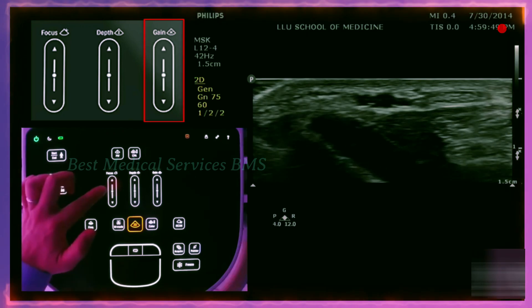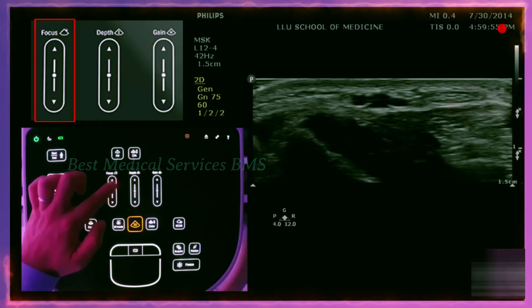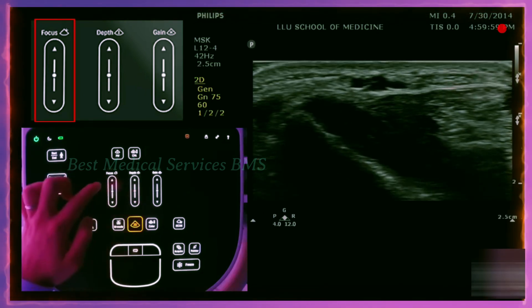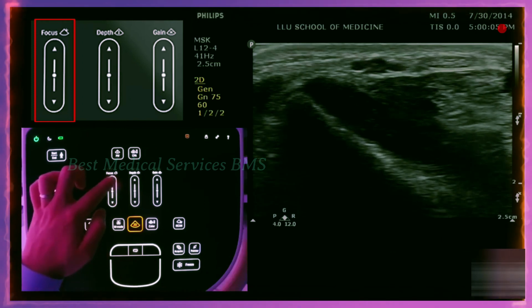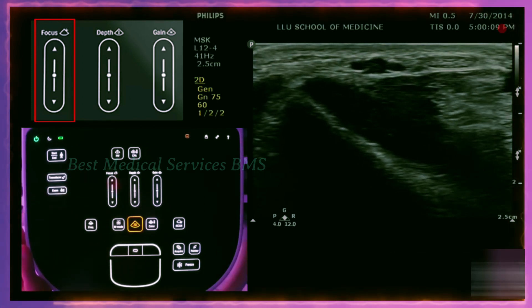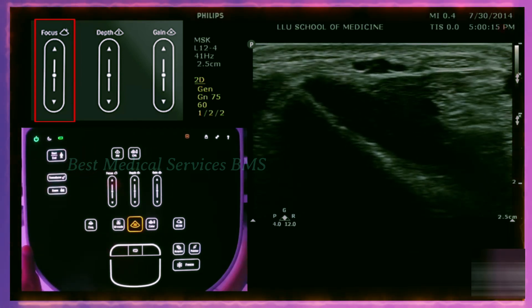The other button that some machines have is the focus button — here to the left is the focus button. If you look on the right side of the screen, there are a couple of arrows, and going up and down moves those arrows up and down on the screen. That corresponds to the focus. When scanning in any mode, make sure the focus is on the area of interest, because that will increase your resolution wherever the focus is.